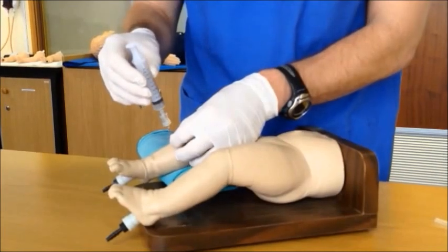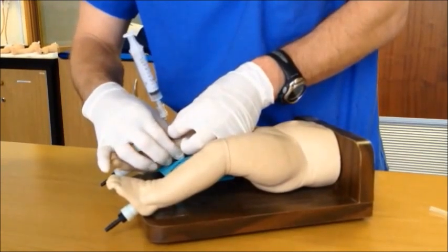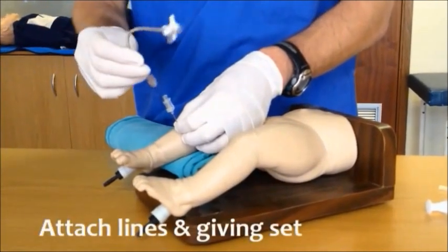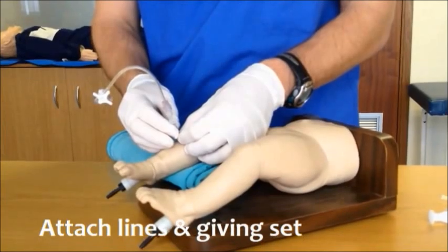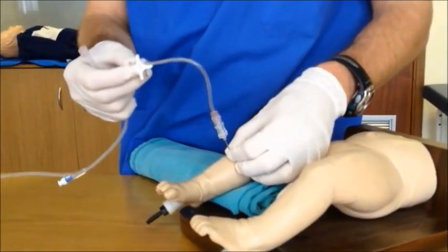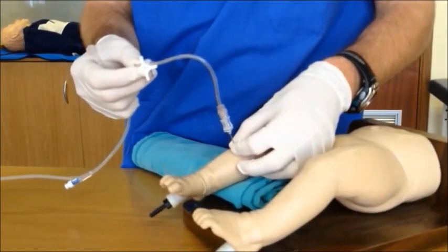Once you have confirmed position, make sure with visual inspection that there is no extravasation of fluid, and palpate the calves on both sides to make sure that there is no extravasation into the posterior compartment. After the syringe has been removed, attach a three-way system and an extension set to the needle. At this point in time, you would connect your intravenous fluid and giving set to the three-way tap system and extension set. Please note that an assistant would now take over securing the needle.